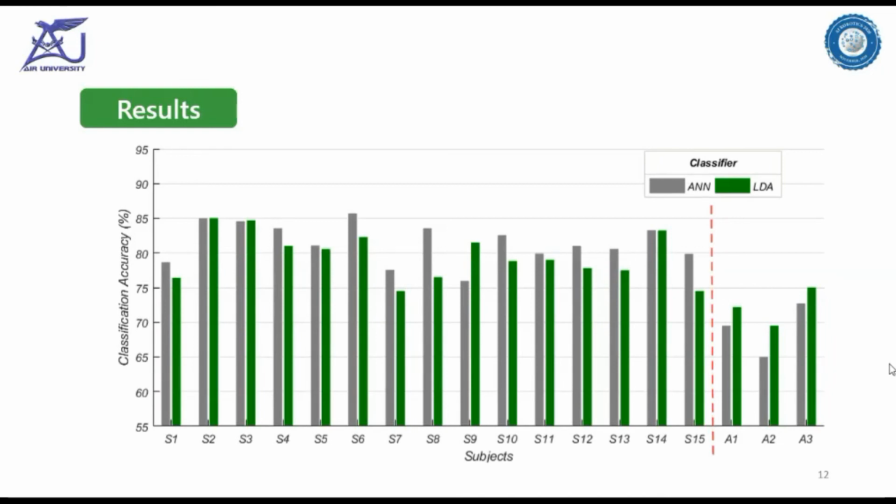So this was also a finding that the more time since amputation, the more the brain hemodynamic responses also die. Nowadays we are working with the prefrontal cortex to generate control commands with logical operations like arithmetic operations or word formation, and that is another story not related to this one. But motor cortex from the brain is not enough to control if there is a lot of time since amputation.